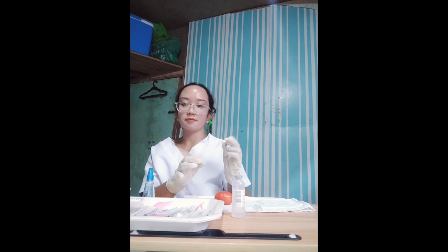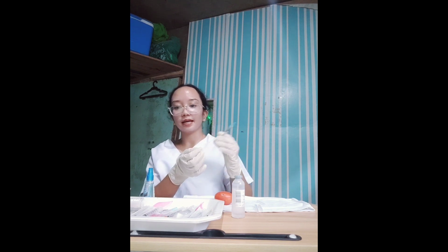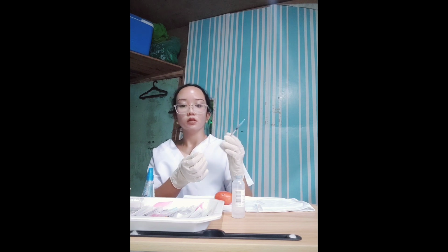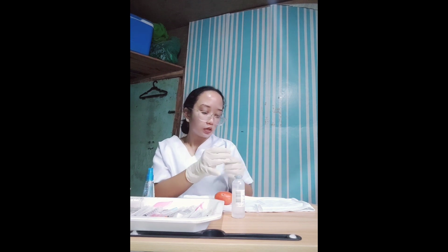So we will grasp the syringe in our dominant hand, close to the hub, holding it between forefinger and thumb. So the possibility of the medication entering the subcutaneous tissues increases when using an angle greater than 10 to 15 degrees.